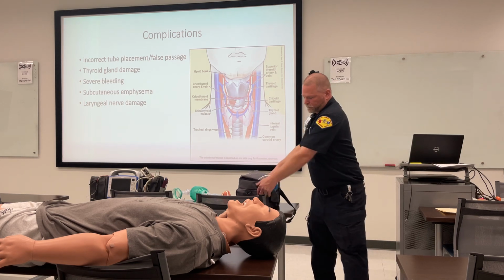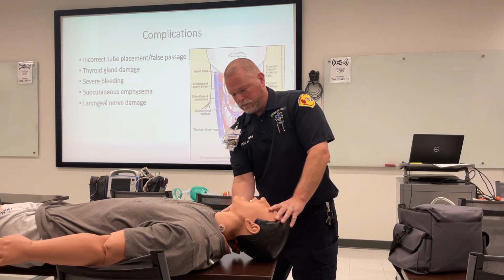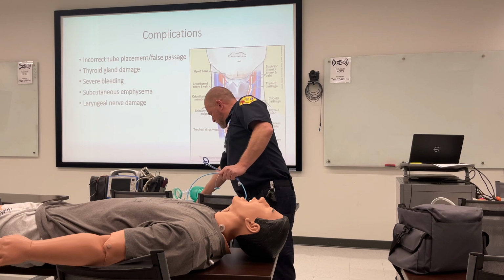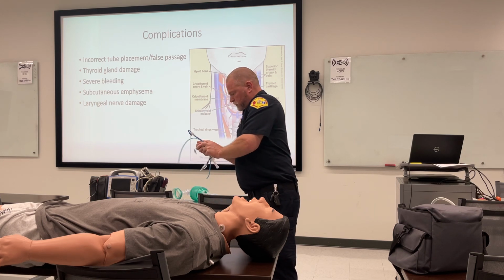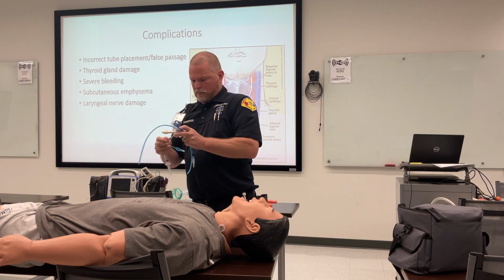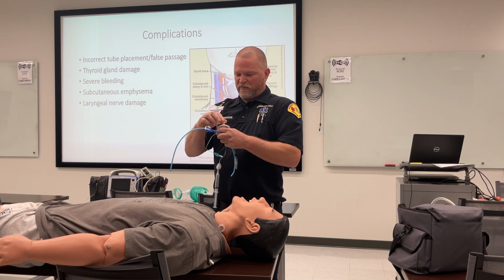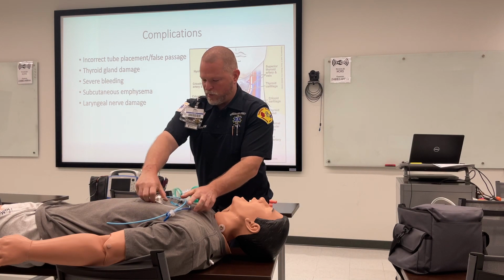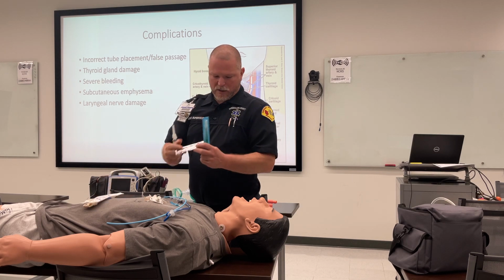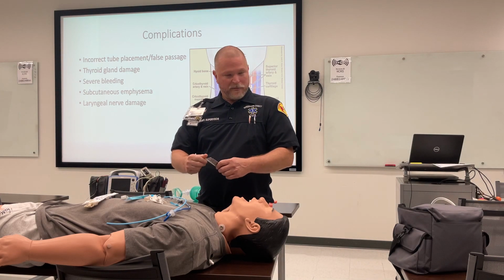We got our suction. We'll have it ready if needed. We're going to hyperextend the neck. Keeps it getting oxygen the best way we can. We've got our tubes. The Shiley that we have comes with an introducer, and it also comes with another tube that you can insert afterward if you need a suction. So we'll have our equipment prepared, laid out. We've got our cleaning device. We're going to have our gloves on. We're going to clean, prep. We're going to clean everything.